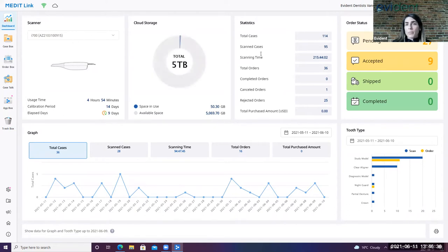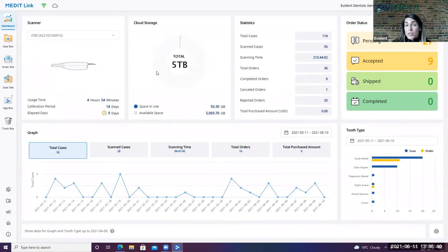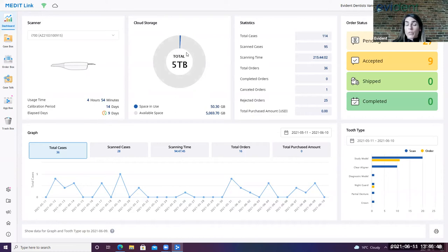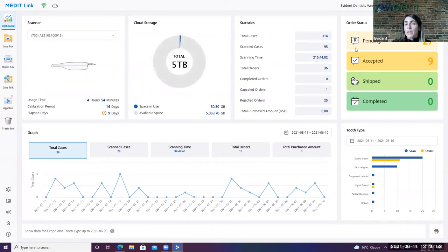On the dashboard, it's a very straightforward place to see a bunch of information relating to your scanner and to your account. You can see your calibration period here, you can see your cloud storage. There's five terabytes of cloud storage with your purchase. You can see statistics as well relating to your scanning time and everything else in between.